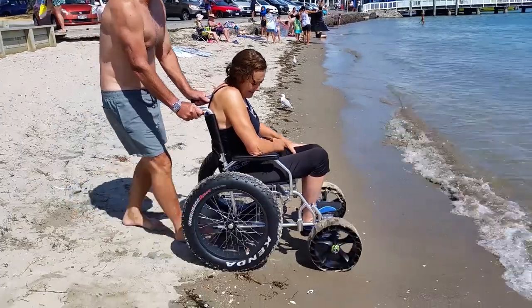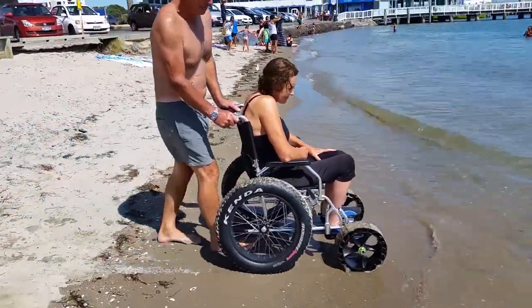This week on Really Good Tips, I'm going to share with you how we made a wheelchair that can access the beach and the water.